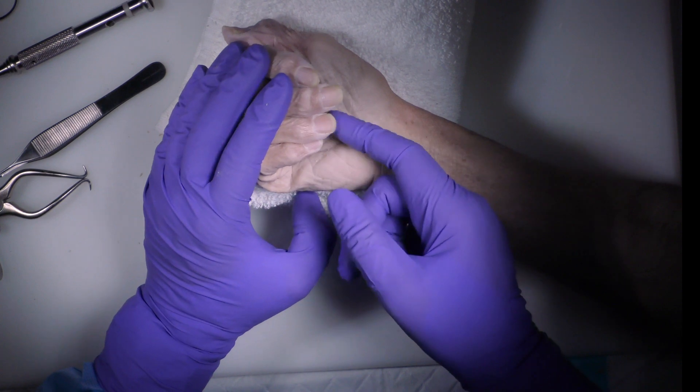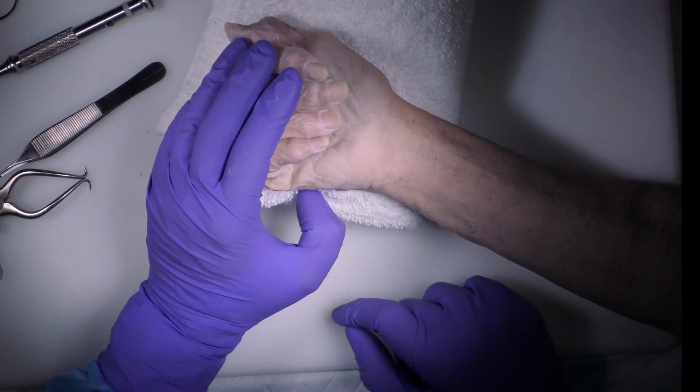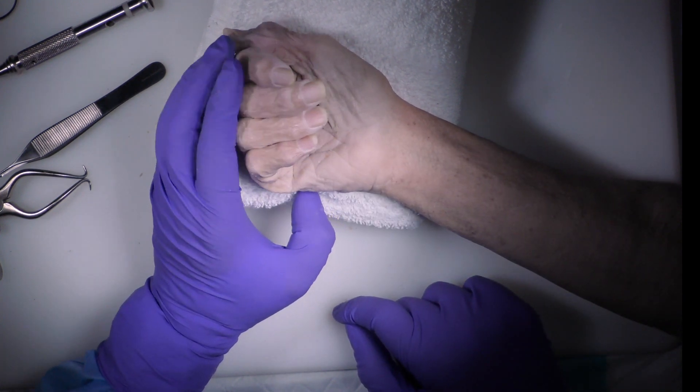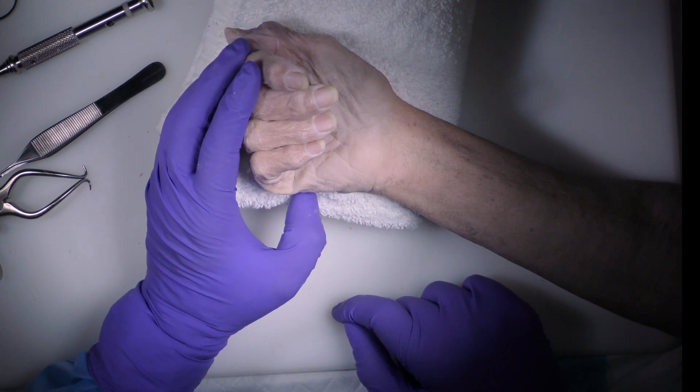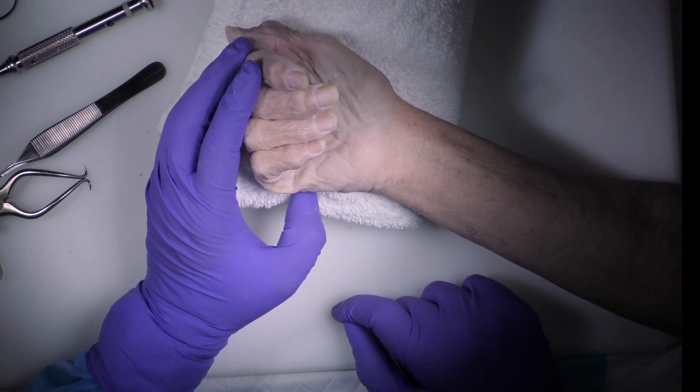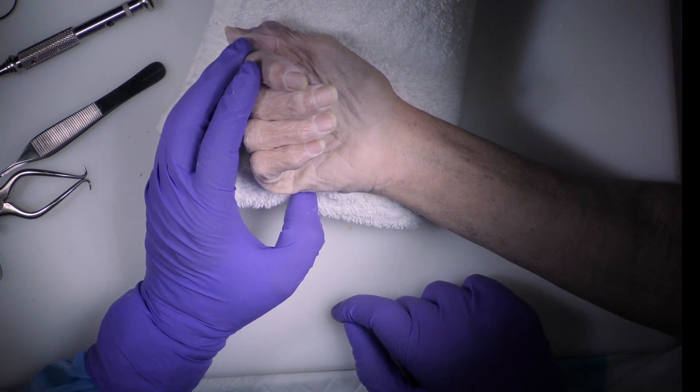The small finger typically just tucks in gently under the ring finger. If you're not sure, you can just check the other side and getting that rotation right is very important so that the patient's not bothered by it. That's often the most common complaint with any kind of finger fracture, regardless of how it's treated, is any kind of crossover or malrotation.